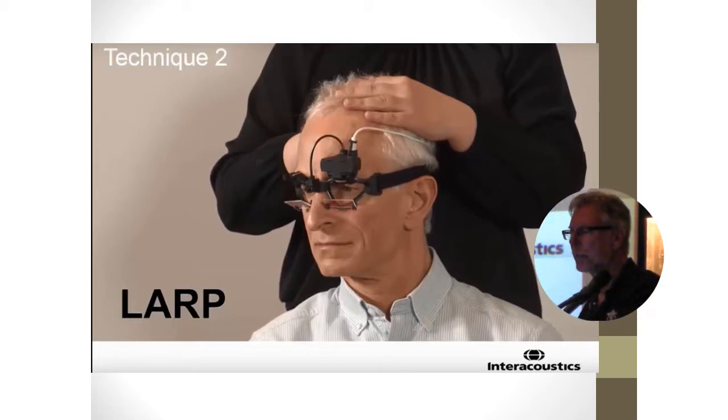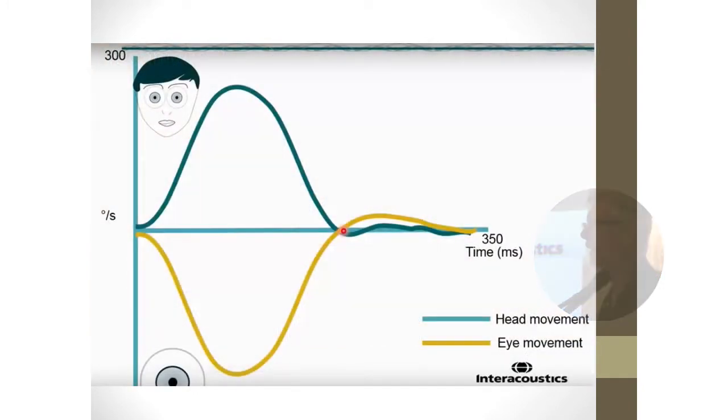And so once you develop the ability to do these, then this is a quick and easy test. And it's very comprehensive because we're talking about all six canals rather than one canal, right? And that's what you would do when you did a caloric test, just a lateral canal.